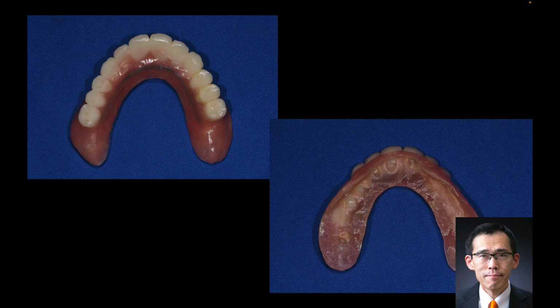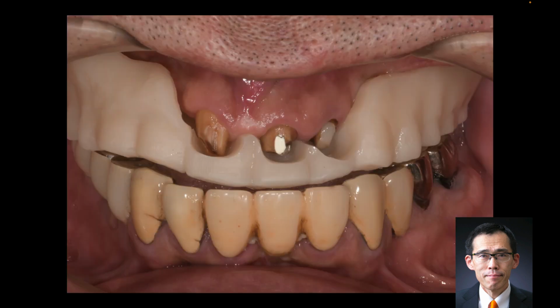He used a removable denture, and we took a bite registration on the 3D printed model.